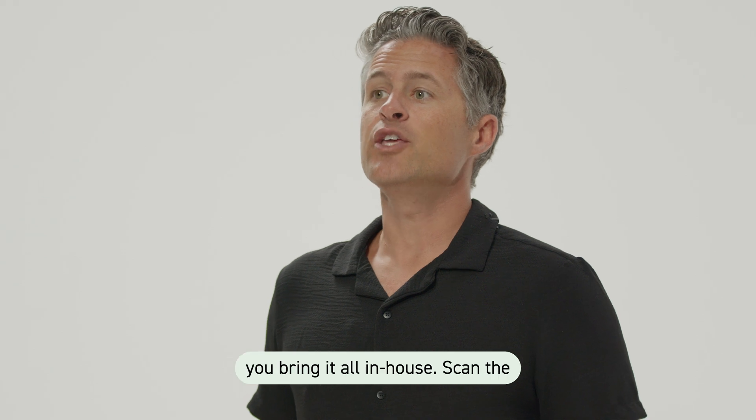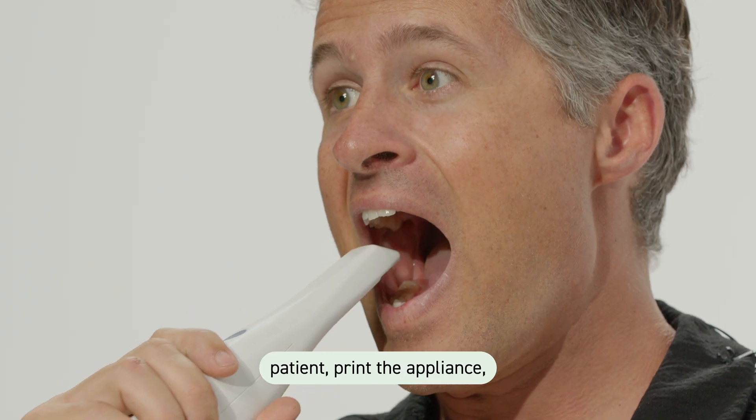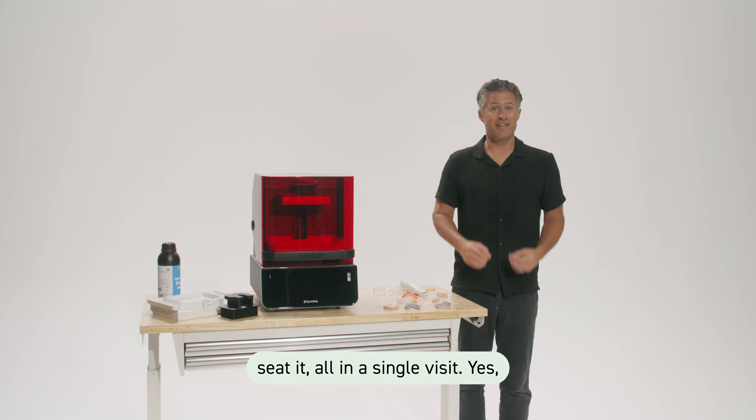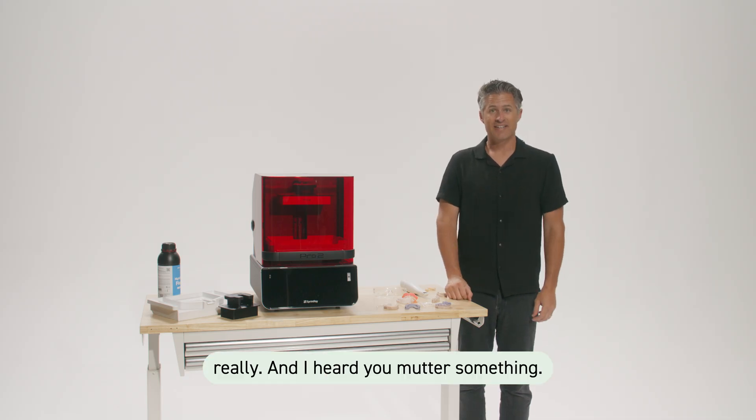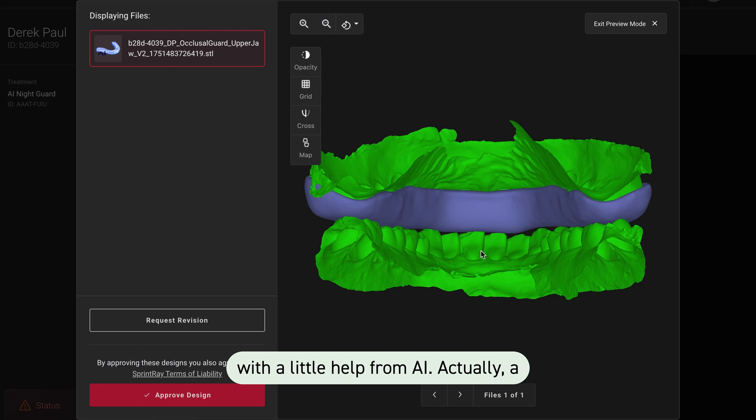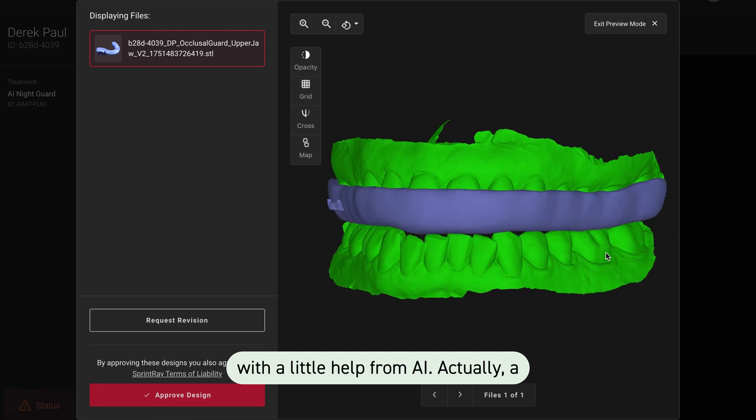With SprintRay, you bring it all in-house. Scan the patient, print the appliance, seat it, all in a single visit. Yes, really. And I heard you mutter something — but who's designing it? We take care of that too, with a little help from AI. Actually, a lot.